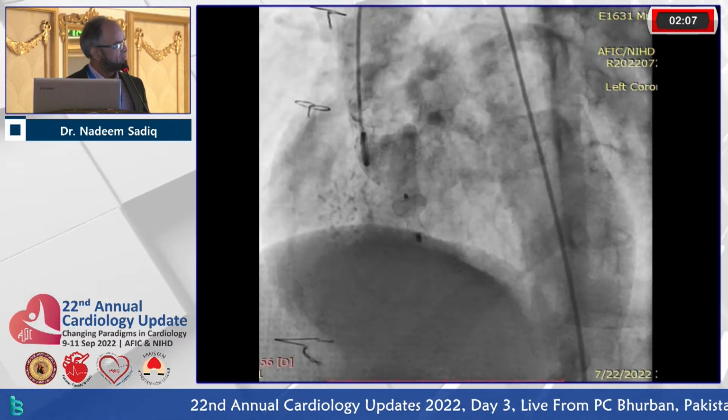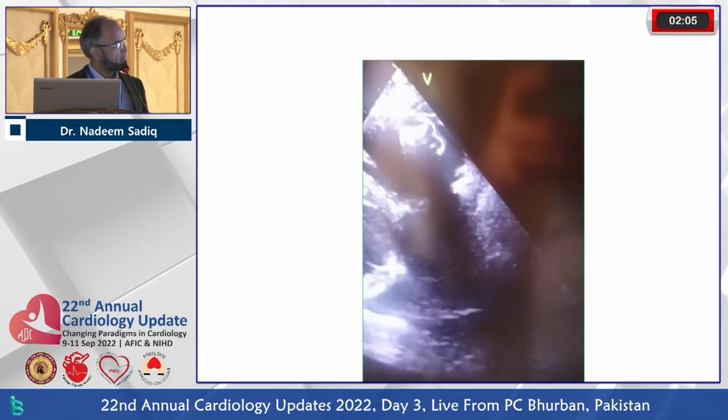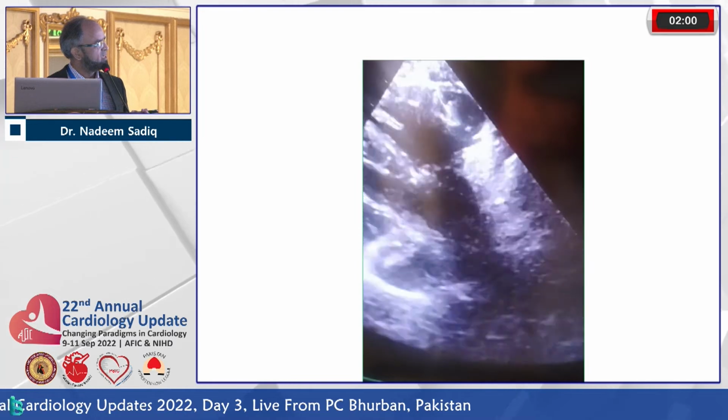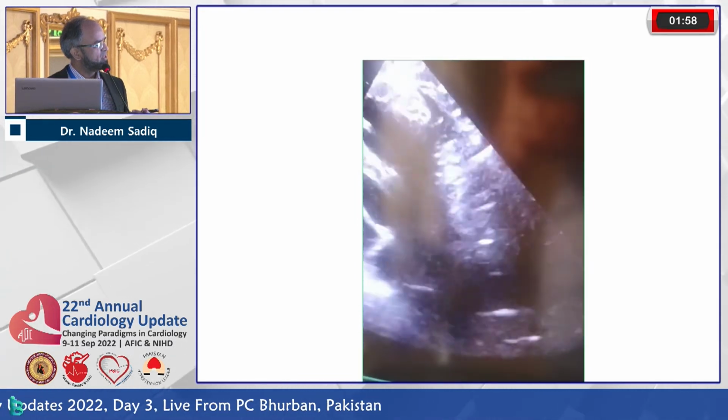And this is the final position of the device, and there was no residual leak. And echo was done after the device closure. This was the tract, and this is the well-placed device in the RVOT.